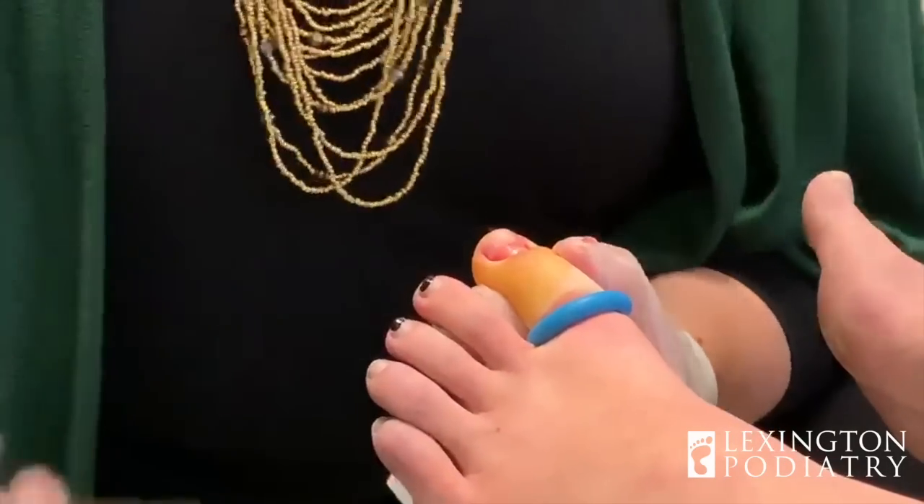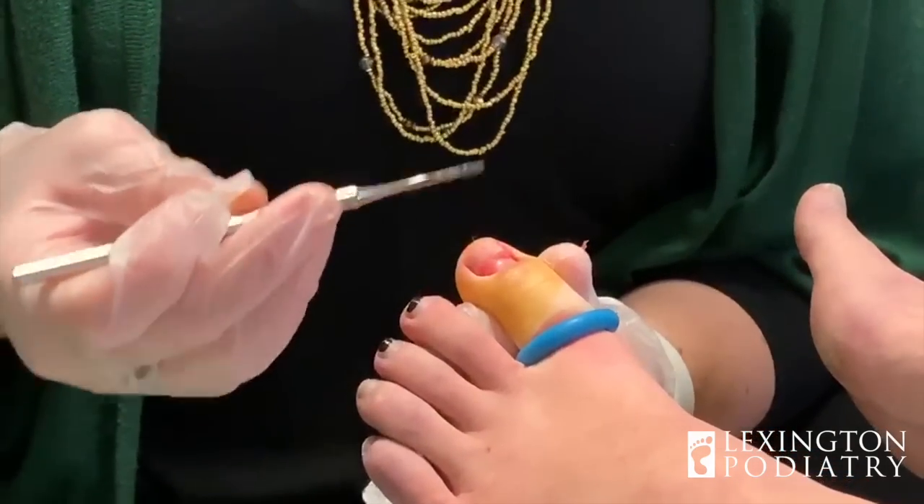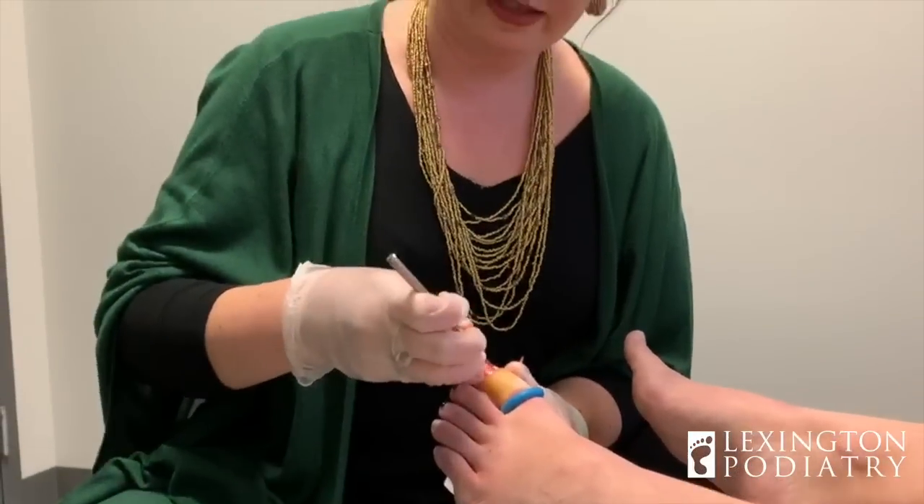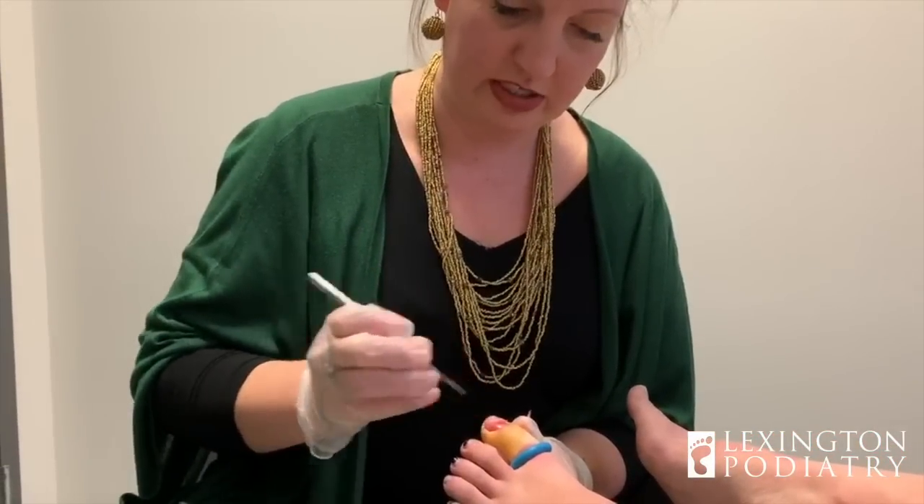So there is a little ridge across here — that is where the nail was loose and was causing damage to the underlying nail bed. So getting the nail off ensures that no further damage is done.